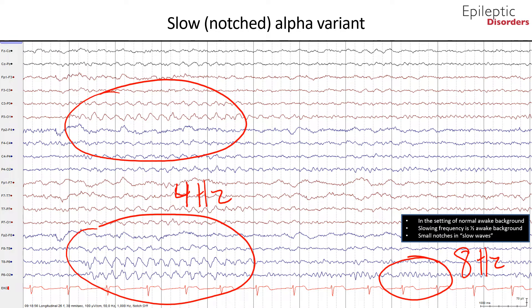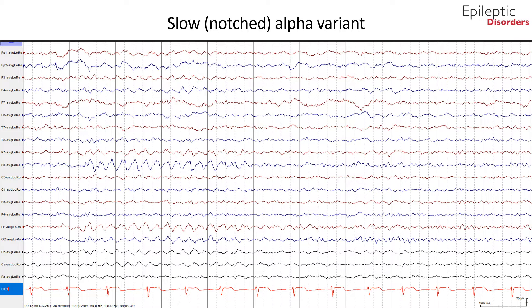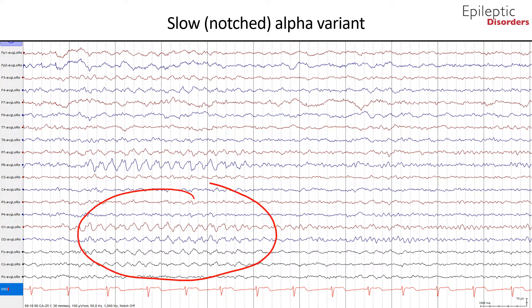In this bipolar montage, you can see slow 4 Hz posterior waves with a notched appearance that is half of the normal background which is 8 Hz, shown in the red outline. Closely pay attention to the normal background activity in addition to the subtle notches that deem this a normal variant. This is an average montage of the same patient showing slow alpha variant of 4 Hz with subtle notches, best appreciated in the O1 and O2 channels and outlined in red.